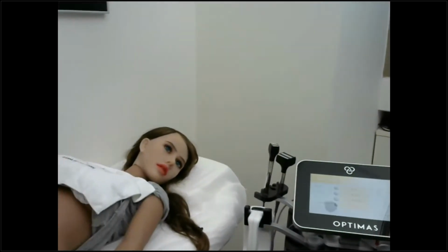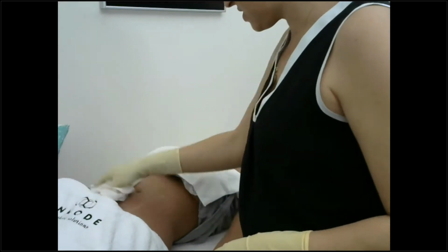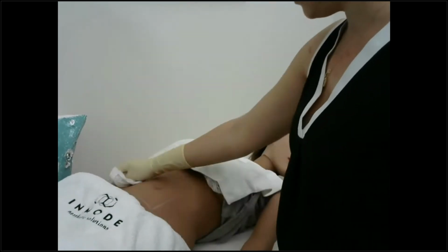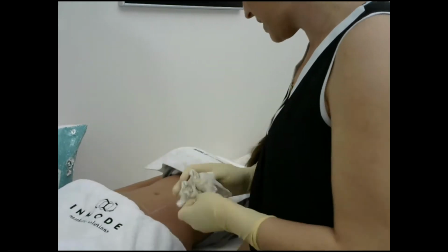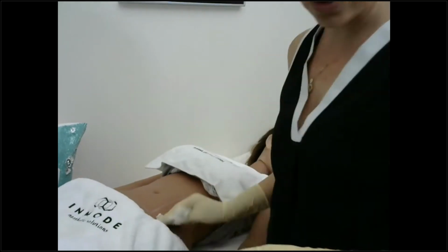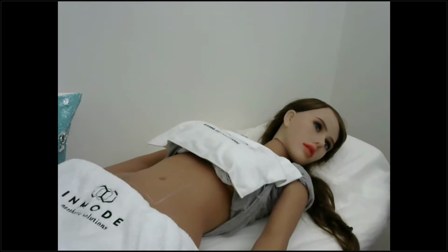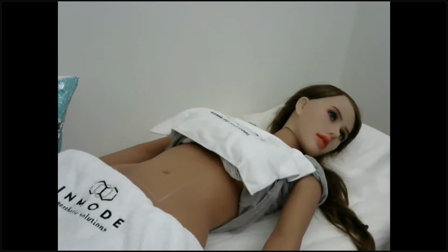I don't want to turn my back to you again, so I will try my best. Okay, so try to ignore the marking of the plus. I will re-mark a treatment area for the body. Okay. So the size of the chamber is about 3 by 7 centimeters, so about 21 centimeters square.